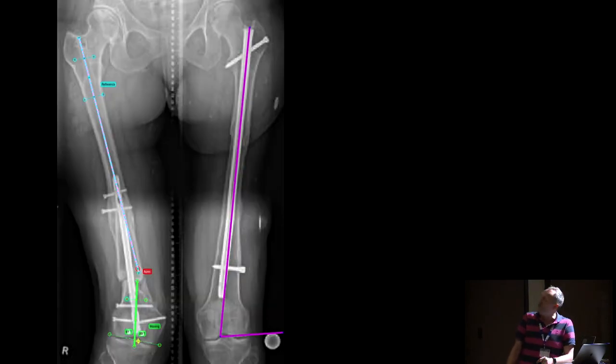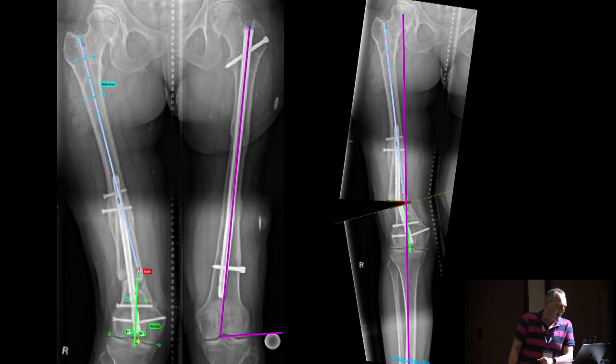So you see here, I've used some deformity planning software to define the deformity and planned a correction. So this was actually slightly cheekily probably using the Hex-Ray software, which is very good, with no intention of ever putting a hexapod on it, but it's the same technique. You could use Bone Ninja. Some of my colleagues use a graphics package, but I prefer something that will actually allow you to draw the lines. It's designed for that method. But you can see this is the correction that was defined by the software with the planning that I had done.